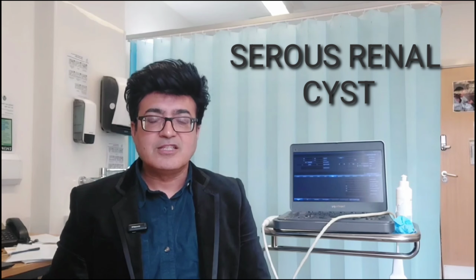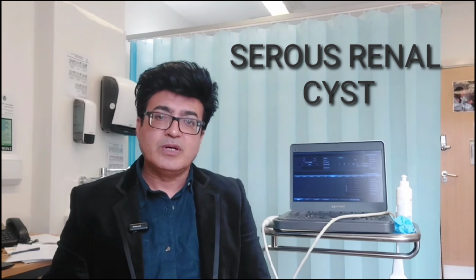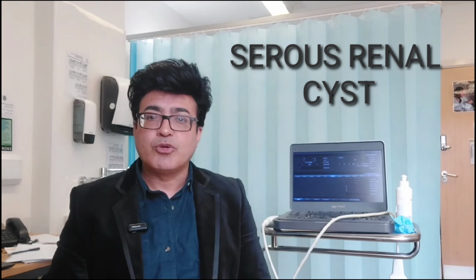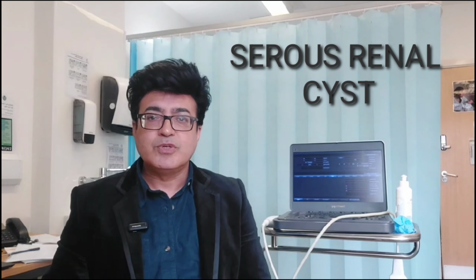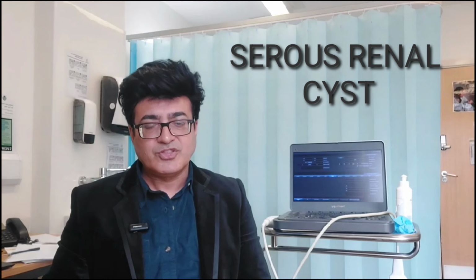Otherwise, serous cyst is a very common entity, and on ultrasound imaging, you will see it will be a thin wall, anechoic lesion, usually in the cortical part, and as I mentioned, it may be simple, single or multiple, small or large. Whatever you come across, just mention the size in the report and label it as a simple renal serous cyst.